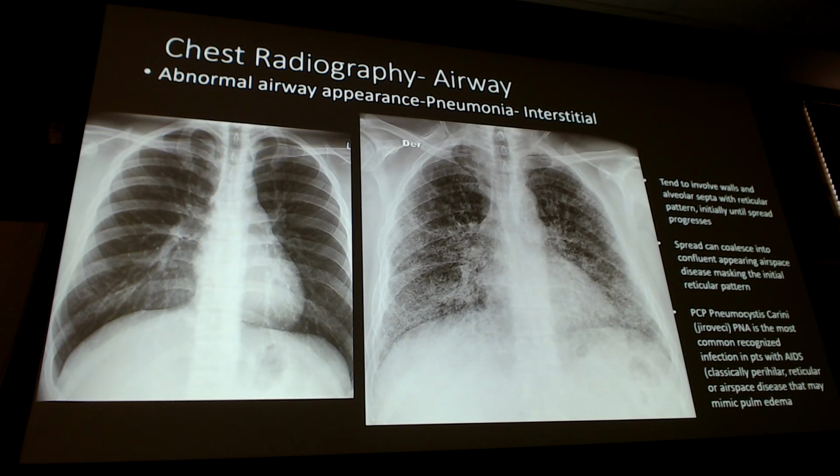Your guy is going to be your PCP, your Pneumocystis carinii, blah, blah, blah, I can't say that one. But this is your immunocompromised patients, okay? Healthy people, the immune system is going to be able to fight that guy off and not necessarily cause this pneumonia. Why do I say this? If you have a patient who's not immunocompromised, and you see an x-ray like this, it's time for you to start asking, why do we have an interstitial pneumonia? I need to make sure that there's not something going on causing you to be immunocompromised.